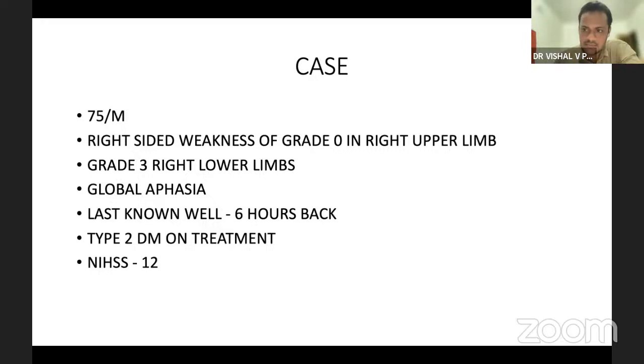Could this be an embolic stroke from the heart? Artery to artery embolism from the carotid stenosis? Must be a clot. What if it was a chronic carotid artery occlusion? You're getting what I'm saying, right? How do you differentiate that? See, there are two, three possibilities here. One, this entire thing could be an embolic phenomenon.